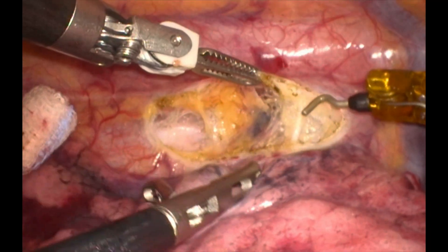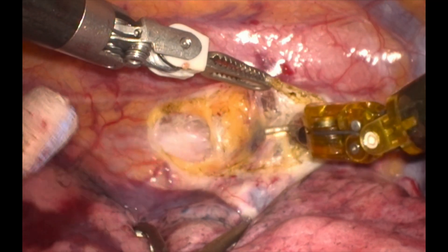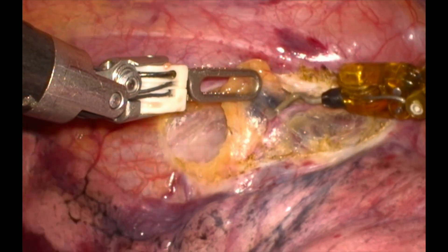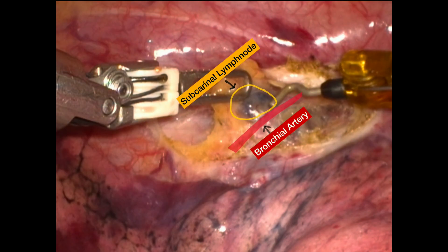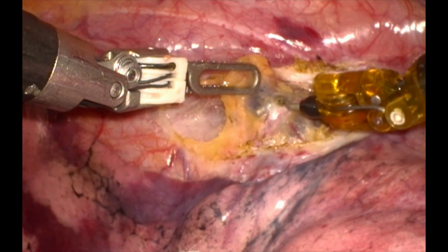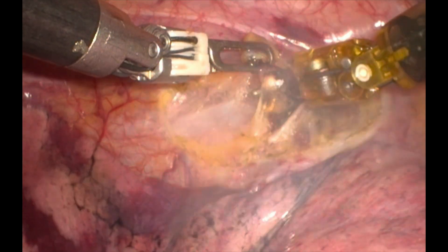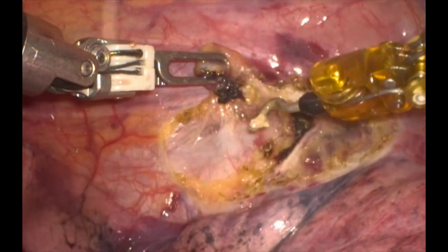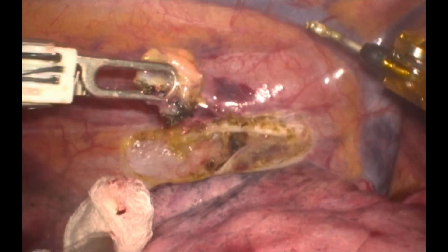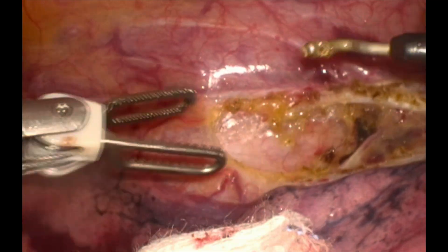Once the mediastinal pleura is cut, you can identify the lymph nodes. This is the subcarinal lymph node and you can see a bronchial artery close to it. You try to preserve it and not to injure it as it is a direct branch of the aorta. Once the subcarinal lymph node is removed, you can see the clear space between the posterior surface of the pericardium and the esophageal surface. The lymph node is retracted through the assistant port.